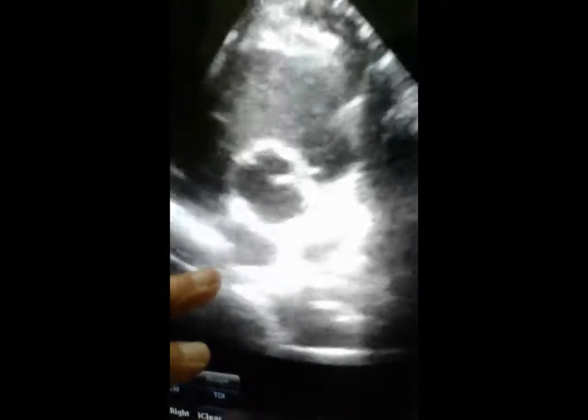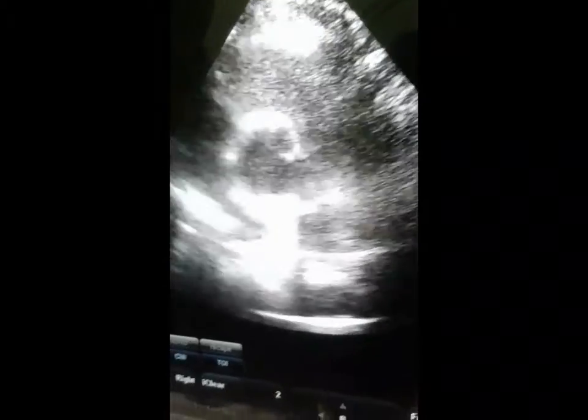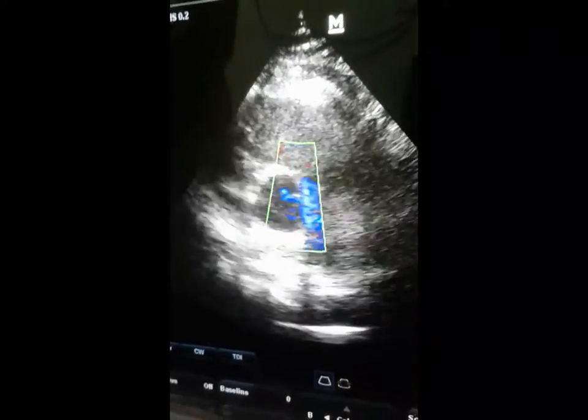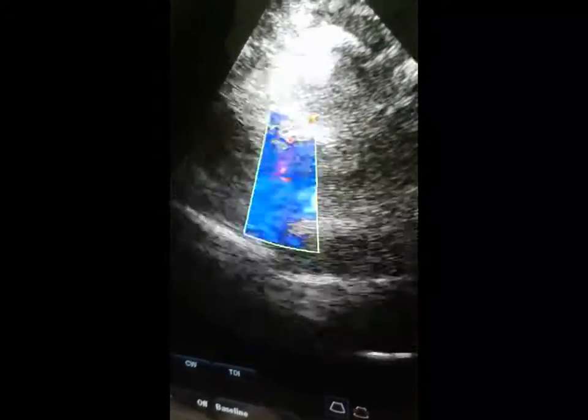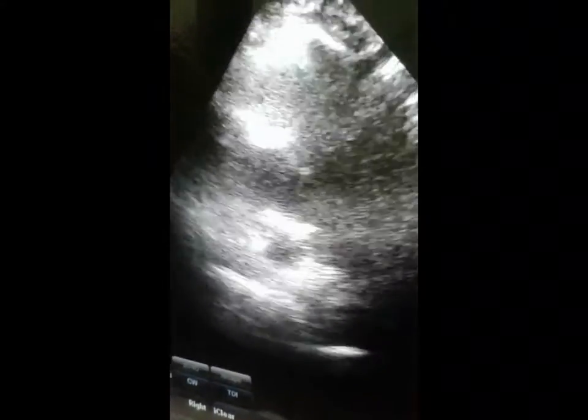Male patient with history of high blood pressure. During echo examination there is regurgitation at the aortic area — mild regurgitation.